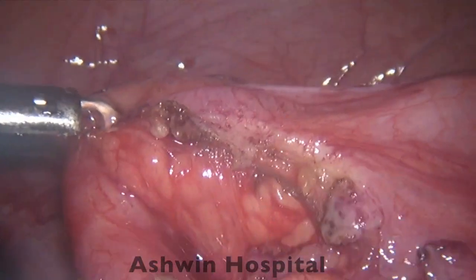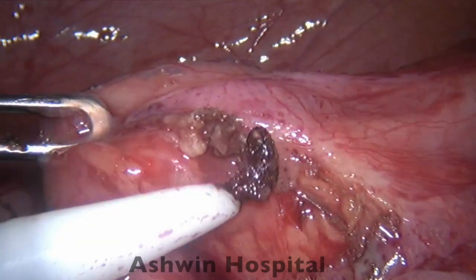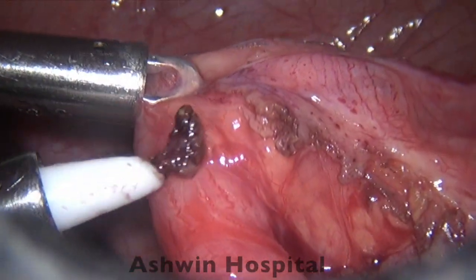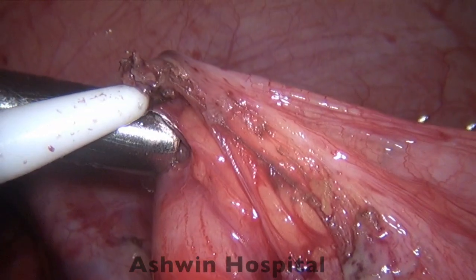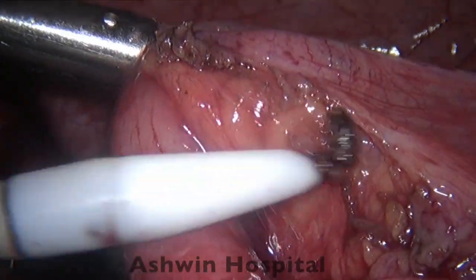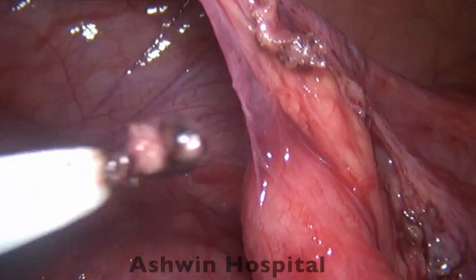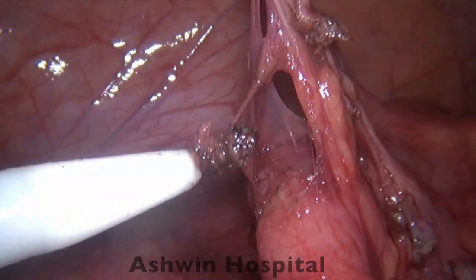When we haven't clearly identified the cecum, this whole peritoneal attachment can look similar to the cecum — we should not mistake it for it, yet must be aware the cecum is very close. We keep identifying the cecum and use it as a landmark to guide our dissection. Small bit by bit, the tissues are taken down with monopolar cautery, and thin fascial attachments over the antimesenteric border of the appendix are coagulated.